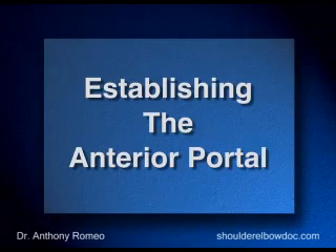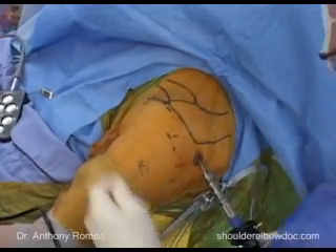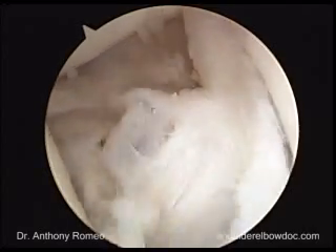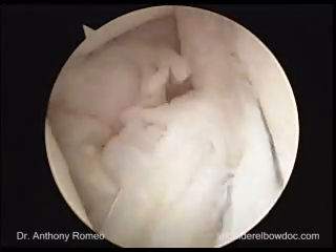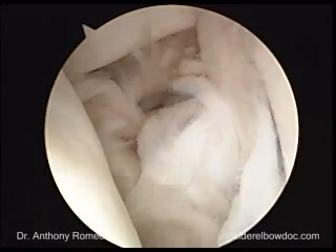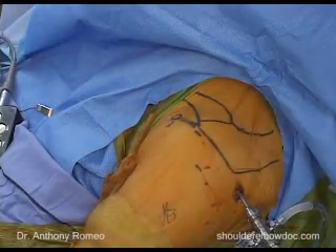There are two ways to develop an anterior portal. One is from outside in using an 18-gauge needle. If your landmarks are fairly accurate, you come off the lateral edge of the coracoid process, come down with an 18-gauge needle, and then identify the spot in the rotator interval where you'd like to place your portal. I've found that the most consistent way to get the portal where we want it is to do it from the inside out.